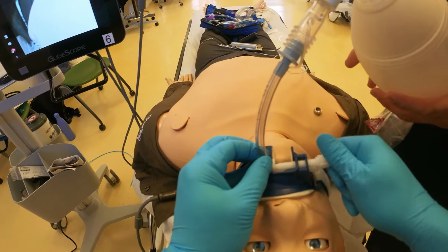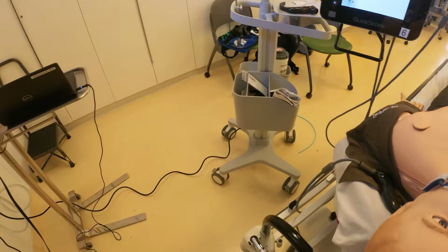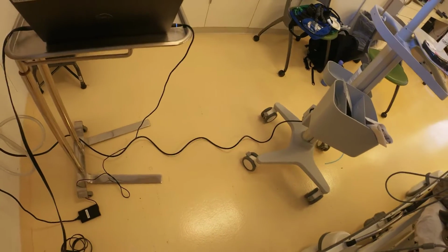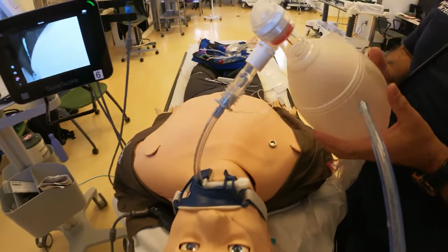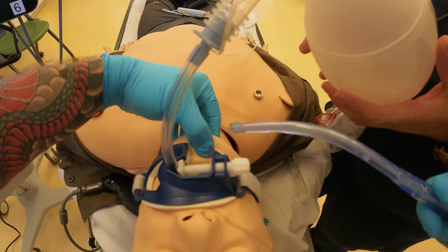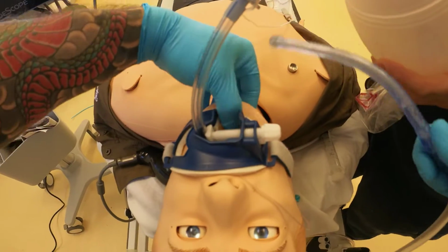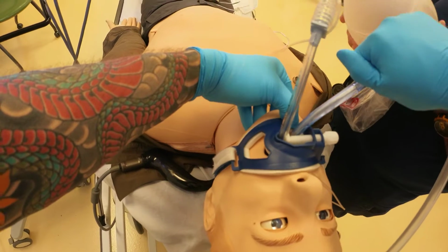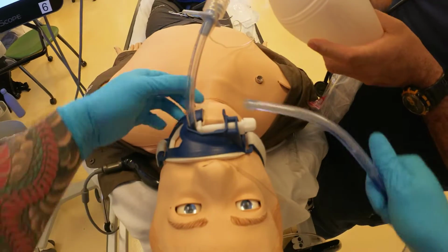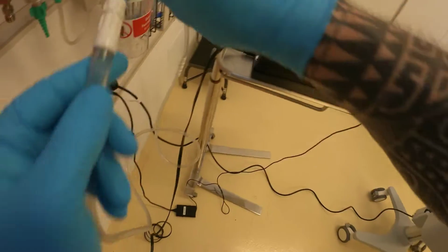And why, you say, okay, what's the purpose of this opening towards the legs? You say, if I wanted to suction with the Yankauer, which I have here, you notice the opening of the mouth, right? This allows me to insert the Yankauer if I need to suction. So if I needed to open the mouth and I come in from the side, it allows me the insertion. If I put this upside down, I cannot advance my Yankauer. So this is why we put it towards the feet, right?